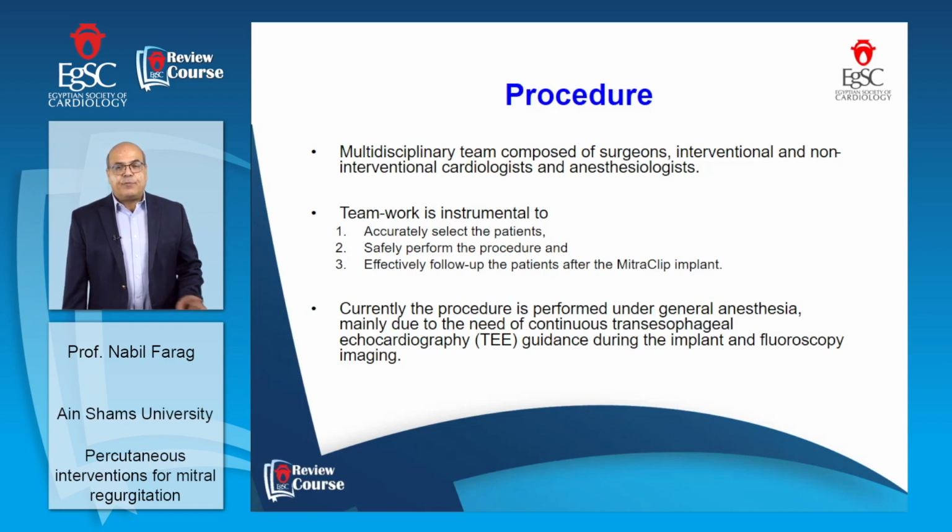Number one, for patient selection, as we described before. So it's very important to select your patient for the success of this new technique. Safely perform the procedure. This team should be trained well to do this procedure, and all of this team share in doing this procedure. And effectively follow up the patients after the mitral clip implants.